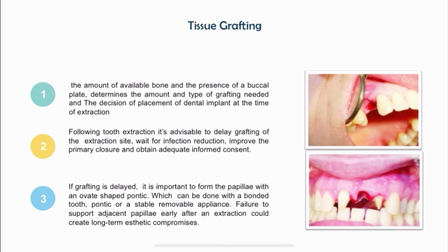If grafting is delayed, keep in mind that we need to form the papilla with an ovate-shaped pontic, using a bonded tooth, a pontic, or a stable removable appliance, because failure of the papillary support will compromise the long-term aesthetic of the area.